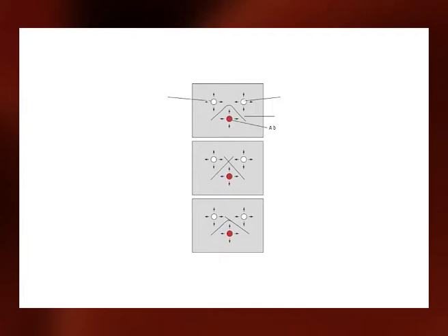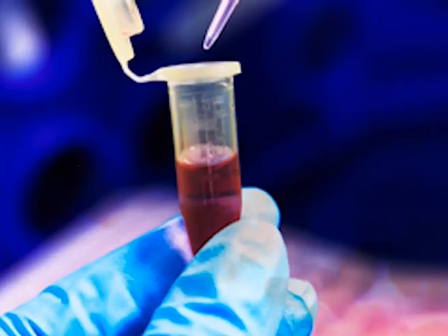Thus, in a species test, a positive result is noted when the precipitate lines for the positive controls and the samples fuse. No spur formation should be observed. Incubation at a cooler temperature is a slower process but has the advantage of producing sharper lines and sometimes additional precipitant lines due to reduced solubility at lower temperatures.